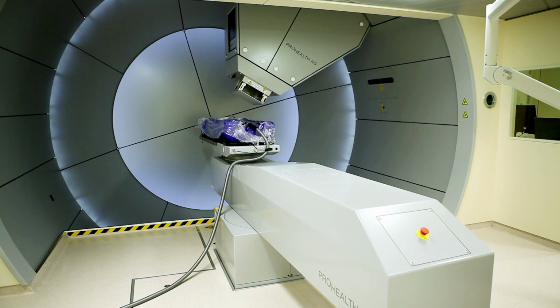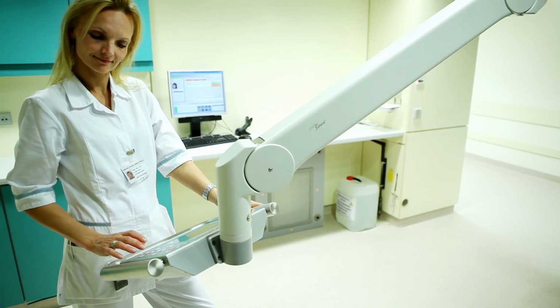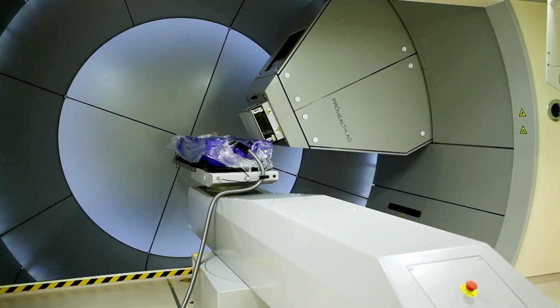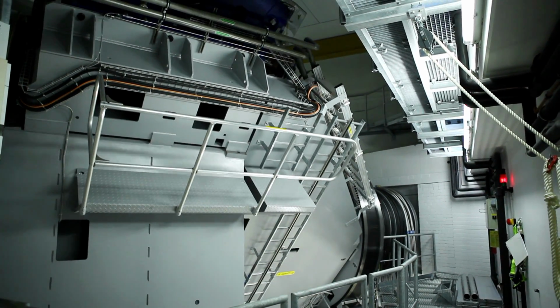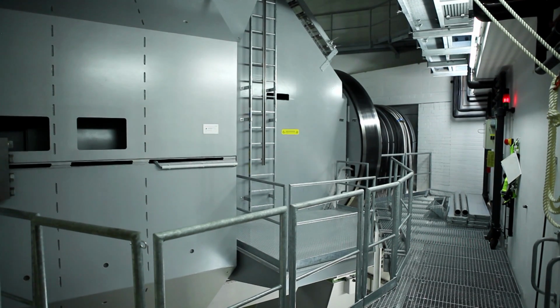So by this, the healthy tissue is saved as much as ever possible. The gantry is moving around the patient, and the beam is always aimed at the tumor itself. Therefore, we have high precision in every area, and if there is something in the way, like functional organs in the body, we can save these organs and treat the tumor afterwards. The gantry has a weight of 150 tons, and it is moved through 360 degrees within 1 minute. This is most important to aim at the tumor from every position from outside. And this makes clear we have the highest possible precision. If you are thinking it takes a lot of time, no, it doesn't. One session of treatment is only about 1 to 2 minutes.